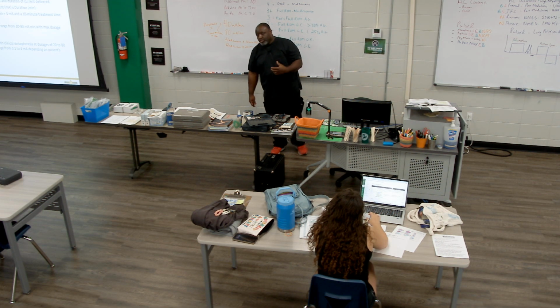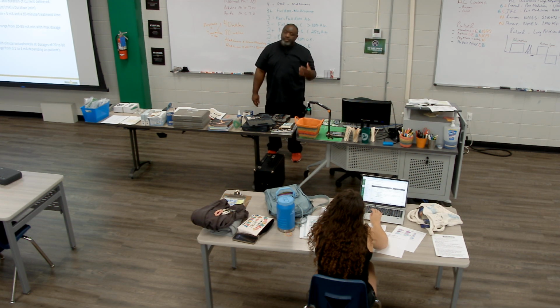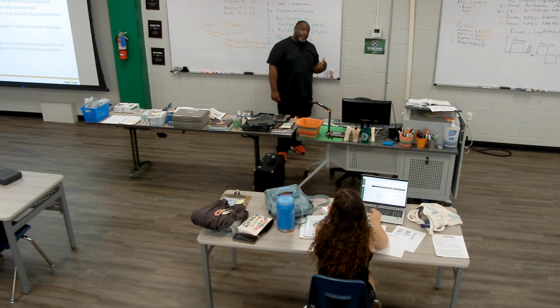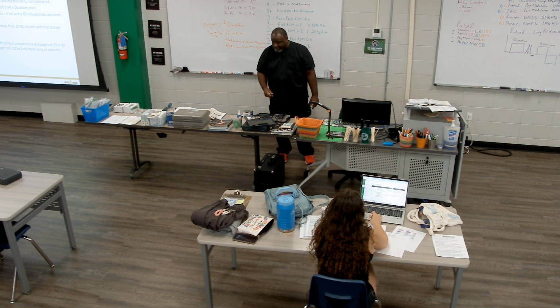We can do the treatments in 40 or 80 milliamp minute increments, and it's still going to be based on the tolerance of our patient to DC current amplitude. So that's what we're dealing with when we're dealing with iontophoresis.